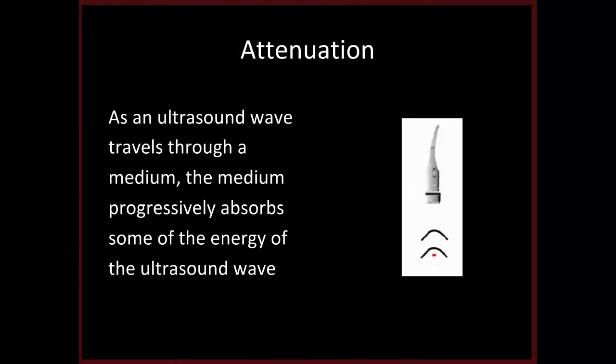Attenuation of ultrasound waves is kind of similar to attenuation when we describe other imaging modalities. It basically means that as the ultrasound wave, as you can see in the animation here, passes through a medium, it will progressively absorb some of the energy of the ultrasound wave. So the further it goes through, the less of the ultrasound wave is actually going to penetrate through the media.